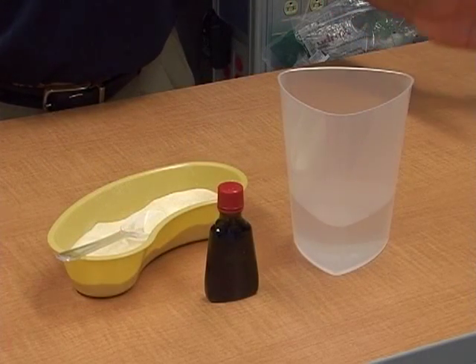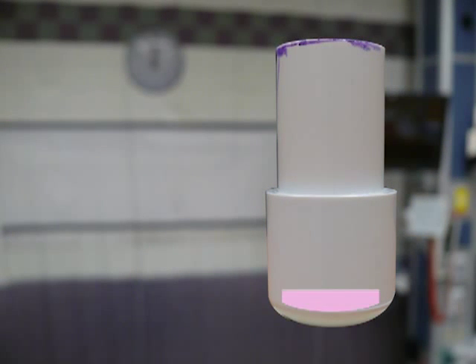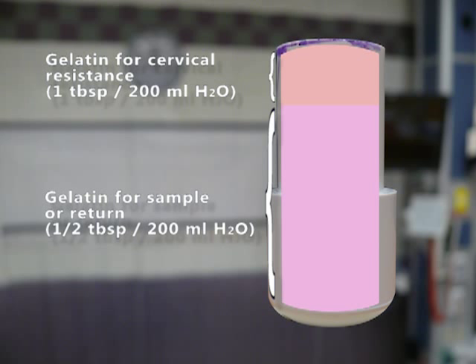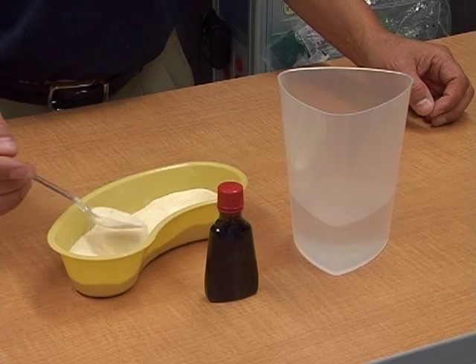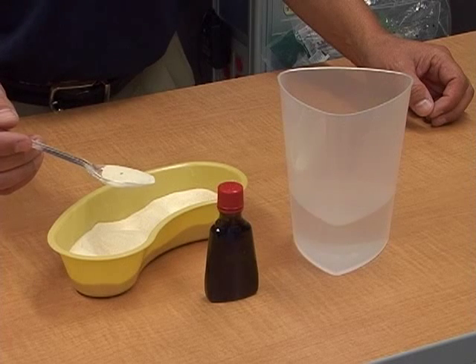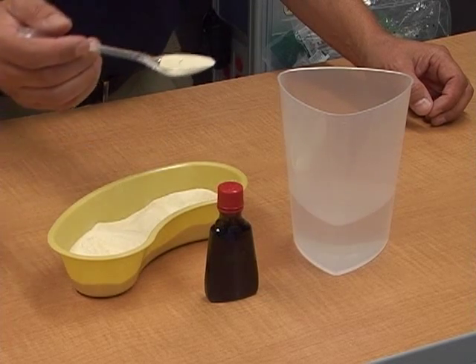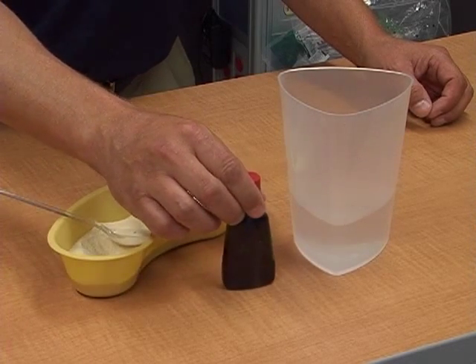Our next step is to make our gelatin. We're going to make two separate gelatins today. One is going to be for the return that you get during your biopsy, and the second gelatin is going to be a little bit thicker for cervical resistance. We're going to start with our first gelatin: take about a half tablespoon of unflavored gelatin and mix that into about 200 milliliters of water. Once you mix it up really well, you can add a little bit of food coloring for effect.